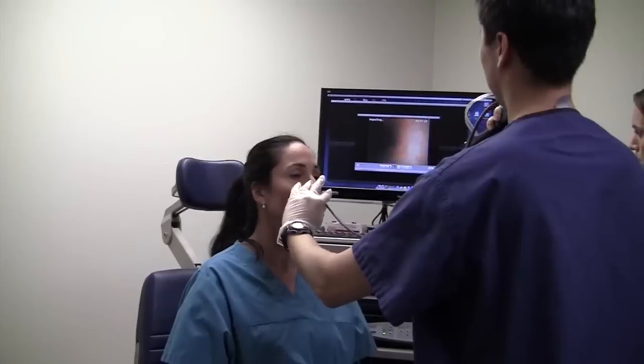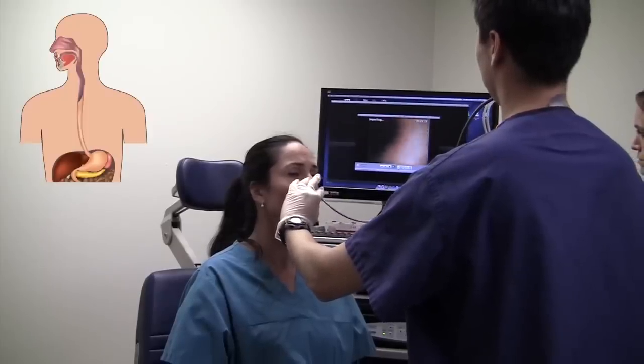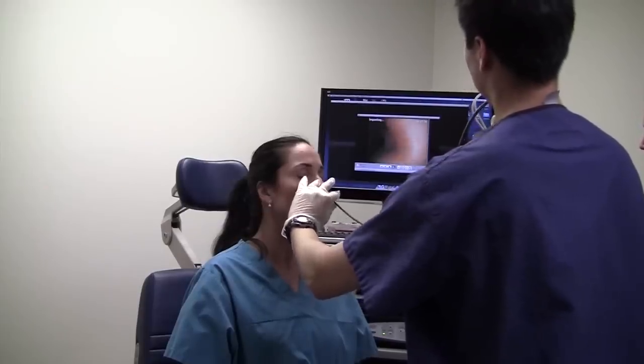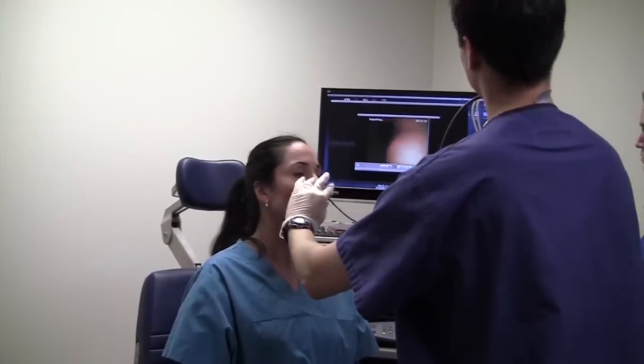The scope is gently threaded towards the stomach while the lining is carefully examined for any abnormalities. Here we have reached the point just behind the heart.